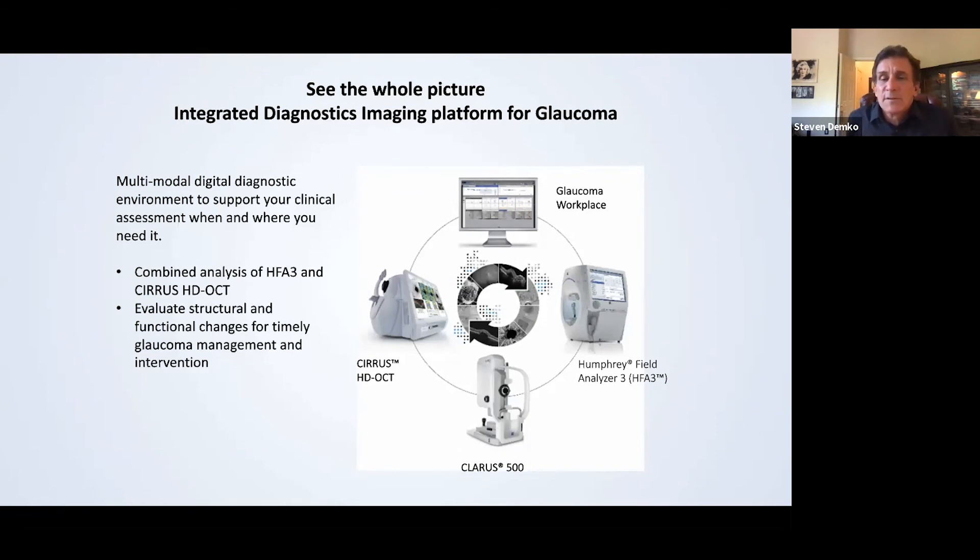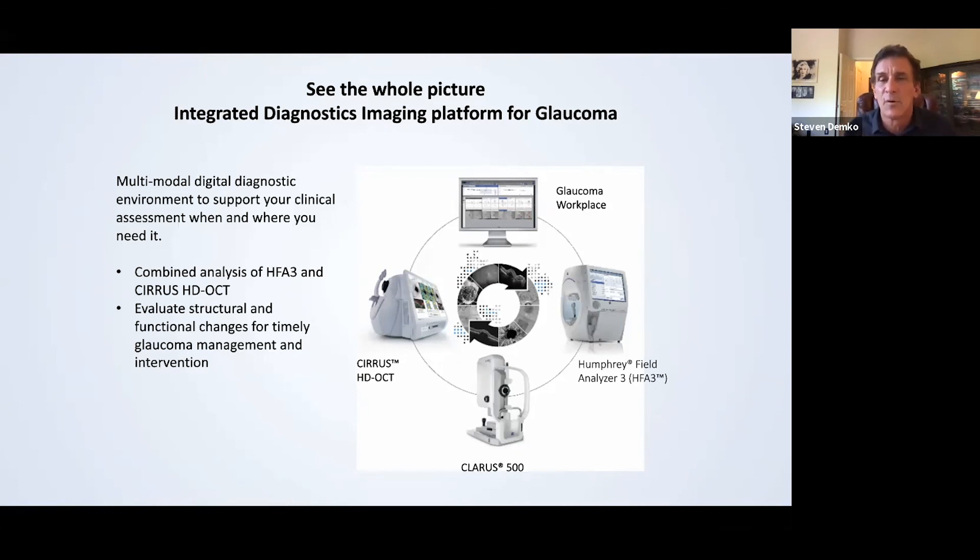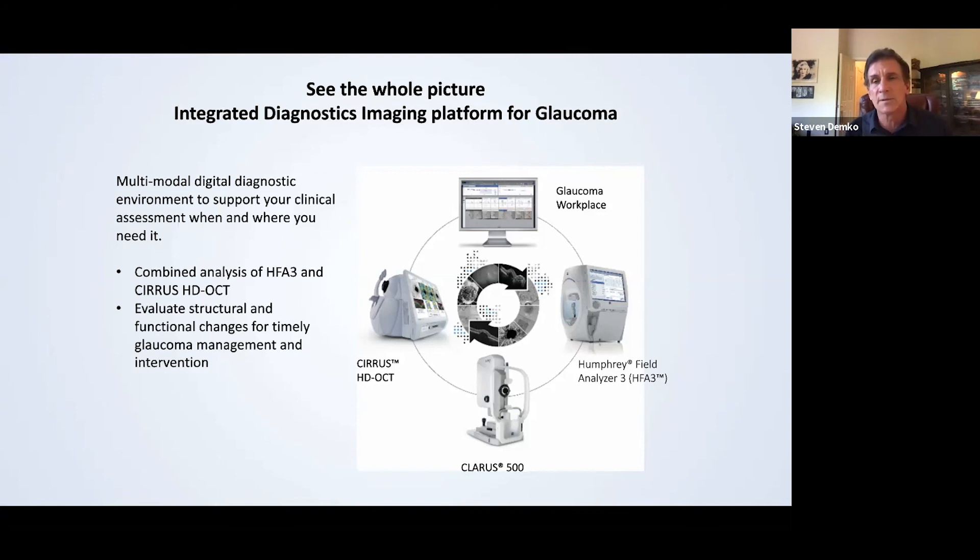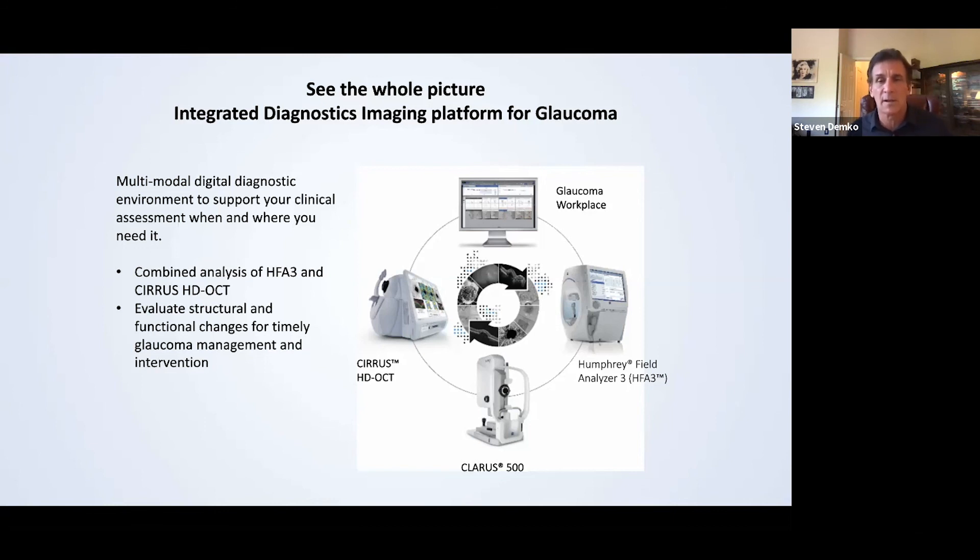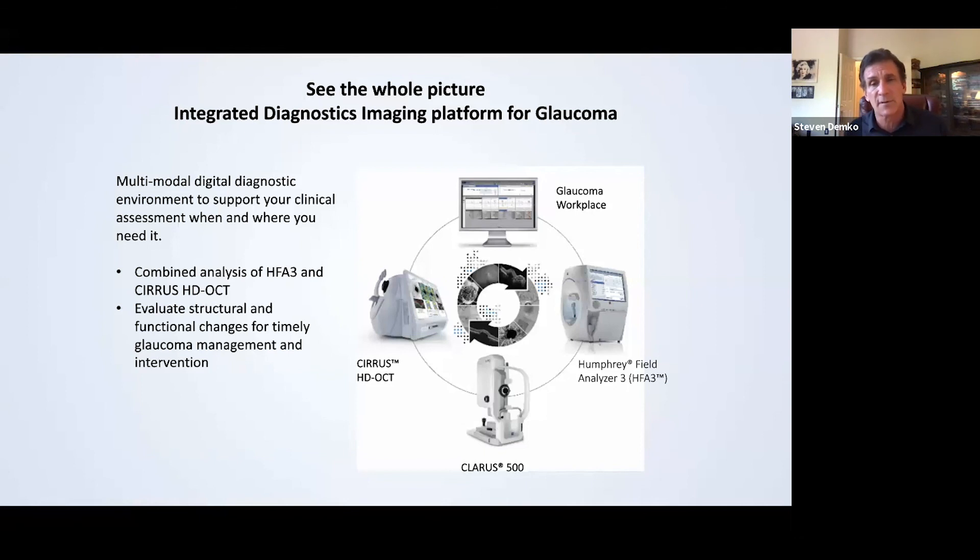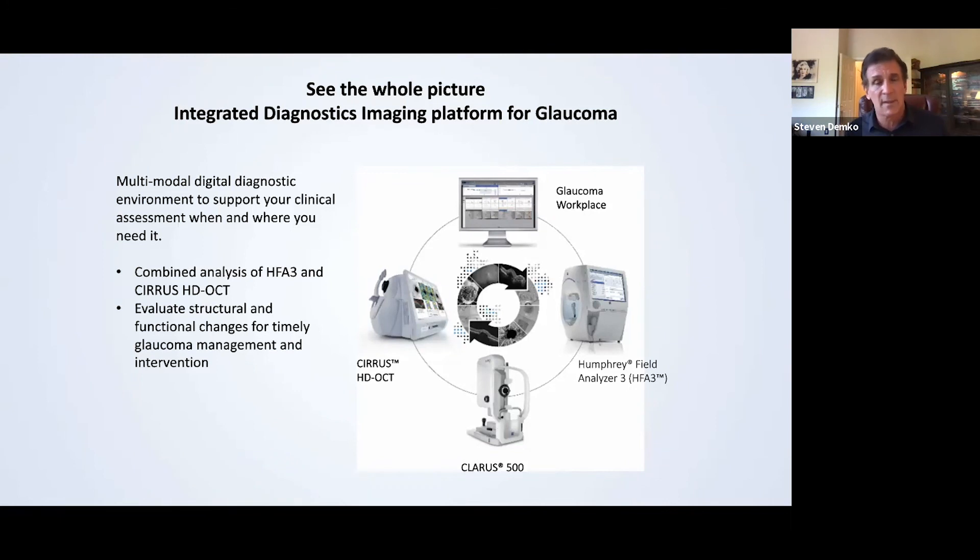So this is my office in general. This is what I have in my office. Up top, you see the FORUM. FORUM takes all of these instruments, the Cirrus, the Claris, the Humphrey Visual Field Analyzer, and it incorporates them. So if you want to look at an image from the OCT and you click on that, in any OCT, it's going to take about 10 to 15 seconds for that image to appear, to be analyzed. If you want to see a different image, you got to push it again. It's going to take 10 or 15 seconds again. And then if you want to look at a different year, it's 10 or 15 seconds, and now you're starting to understand.